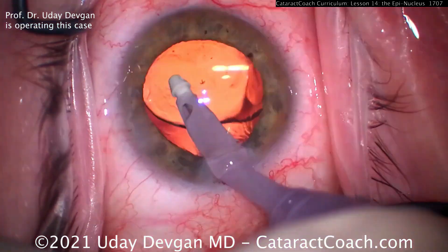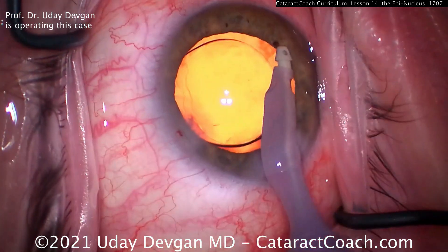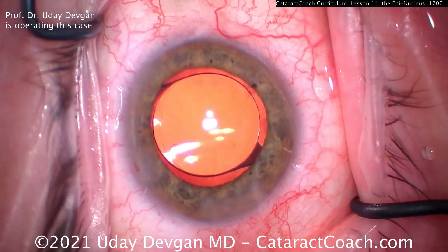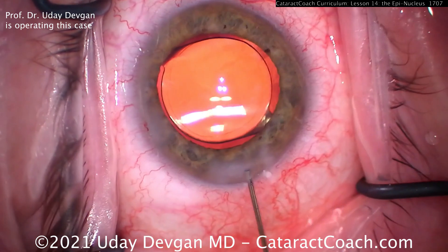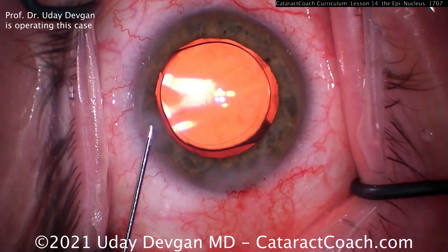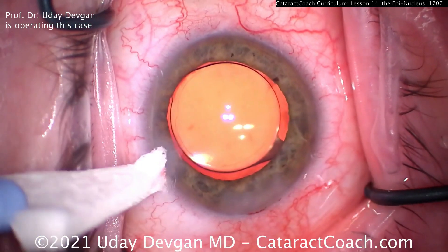Here we're finishing up the case — a very efficient case. Perfect incision, beautiful capsulorrhexis, lens in the bag, a super efficient case with bare minimum energy and a very nice result. Let's hydrate the incisions and finish up. If you've got an interesting case, go to CataractCoach.com, click the link and submit the video — I want to learn from you. Sign up for the free daily email and we'll get a video like this to you every single day.